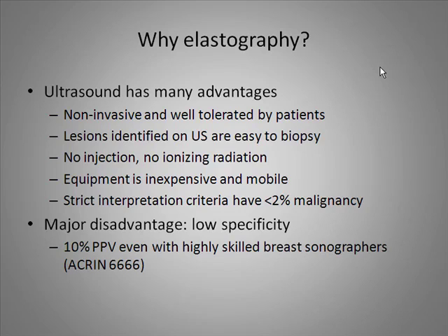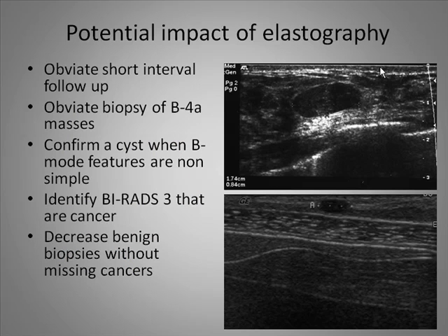Now, there is also a major disadvantage, which is low specificity. Even with highly skilled breast sonographers, the positive predictive value of a biopsy recommendation is about 10%. That means 9 out of every 10 biopsies is benign. That is a high burden for women and a high burden for society.